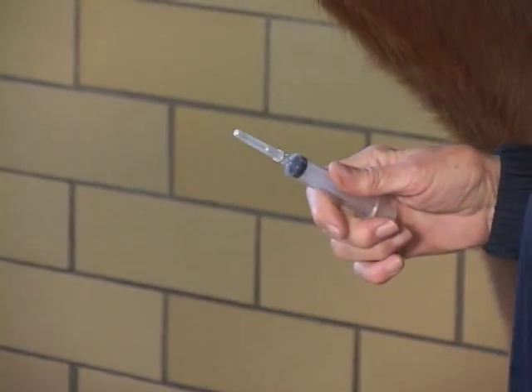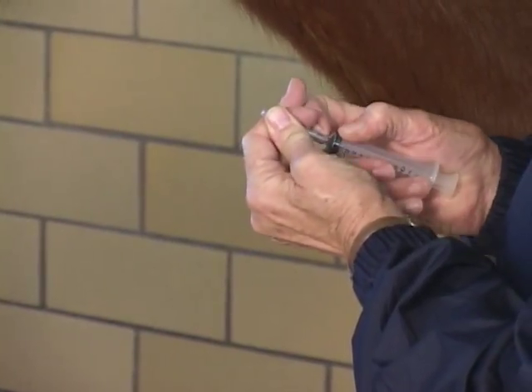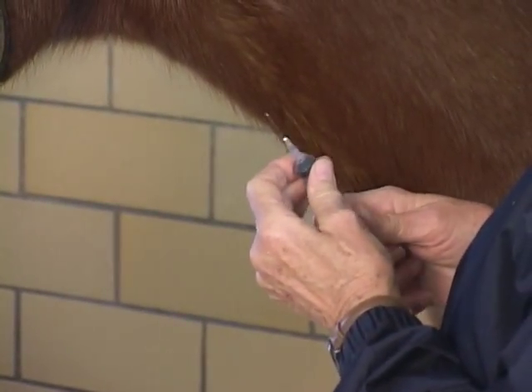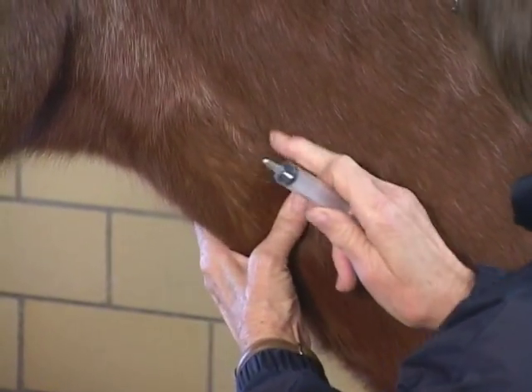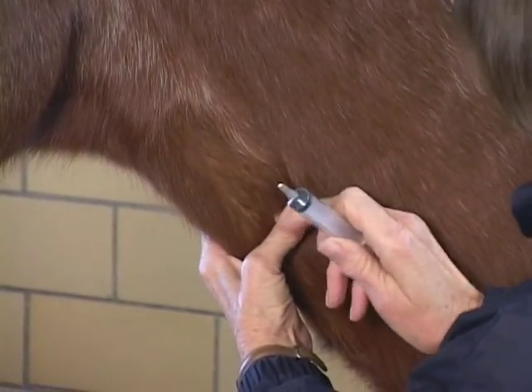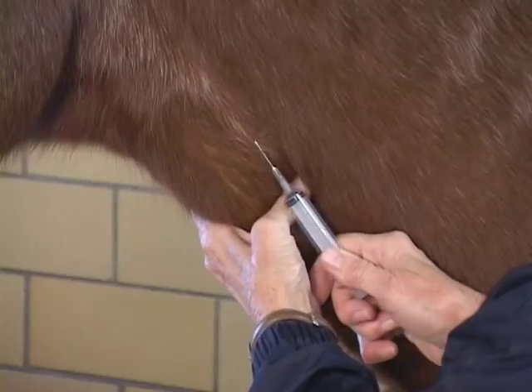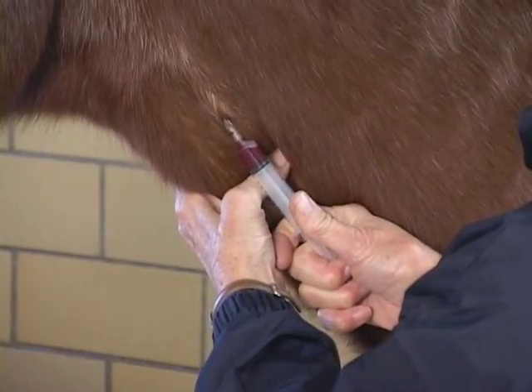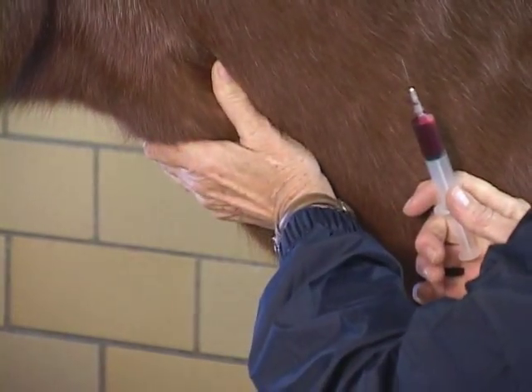Dr. Hamill, do you like to draw blood with the needle on the syringe? Yes, actually I do. If I'm drawing blood I'll keep it on, but if I'm injecting I'll take it off. You'll see people doing it different ways — it's just a stylistic difference, there's really no difference to it. So I'm going to get the jugular to stand up well. I usually try to have the syringe and needle braced somehow — I'm bracing it against my thumb. I'm still maintaining some pressure on that jugular with my thumb when I'm done.